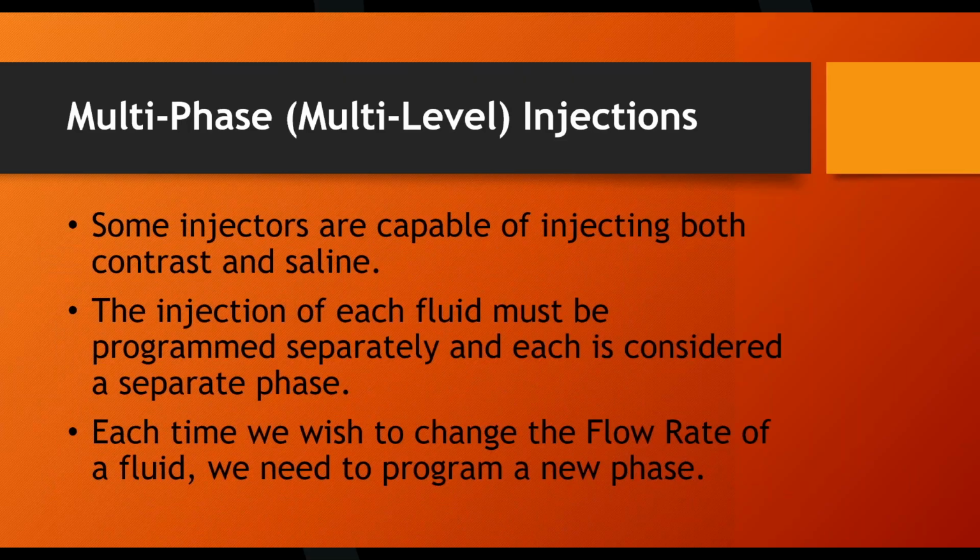As soon as that injection's over, immediately goes to saline. Should have done more saline. That was anticlimactic. But that is one injection. So that's a 2-phase injection.